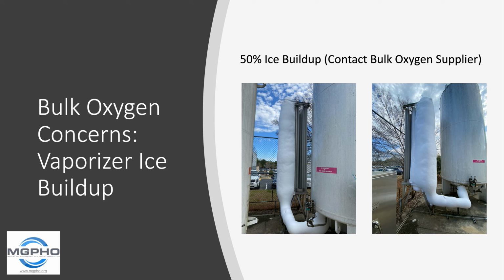But at this point, this would be a good time to go ahead and contact your bulk service technician, your bulk oxygen supplier, and let them come out to assess the situation.